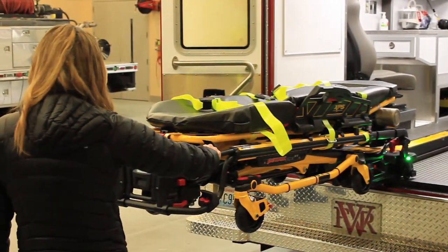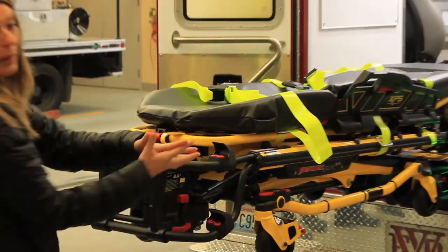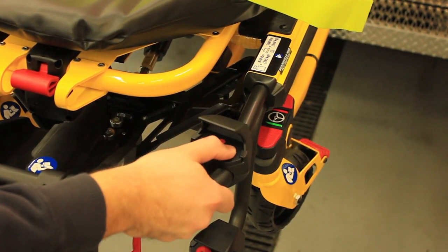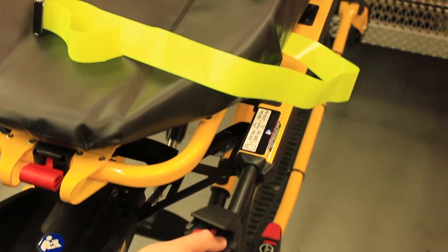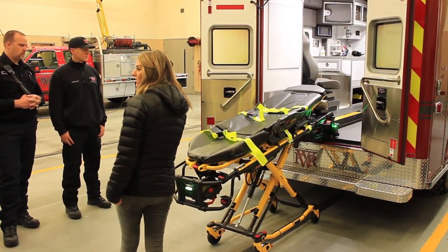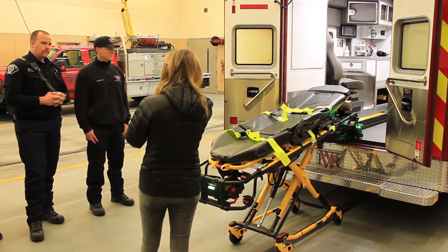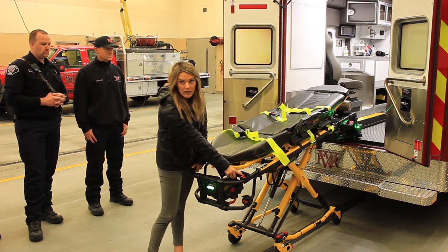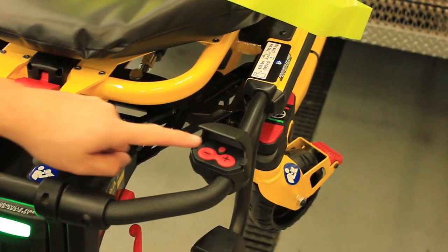When you see that light turn green, press and hold down the plus button — because the plus makes it bigger and the minus makes it smaller. Press and hold down the plus button until you hear the pitch change. When you hear that pitch change, you can stop pressing the button because the loading arms are coming down automatically at that point. When it's all the way down, there's a little wireless release button above the plus and minus. Press that and pull out.